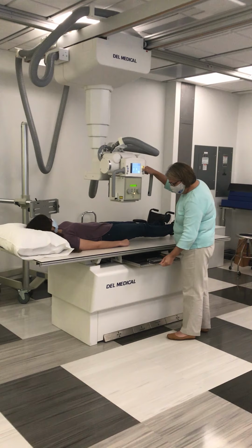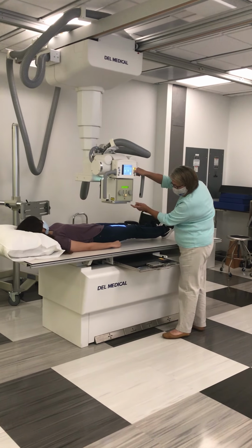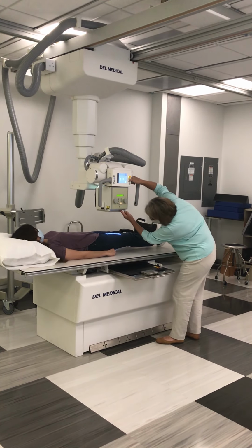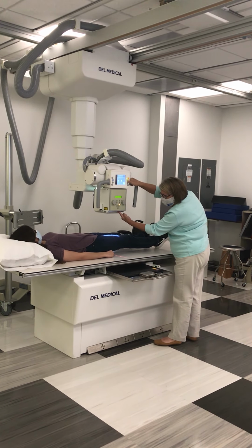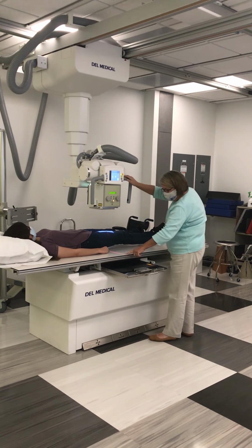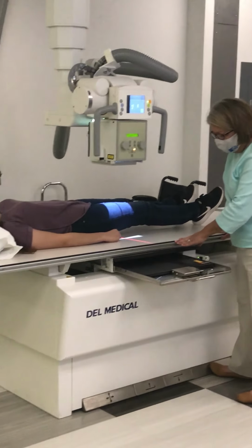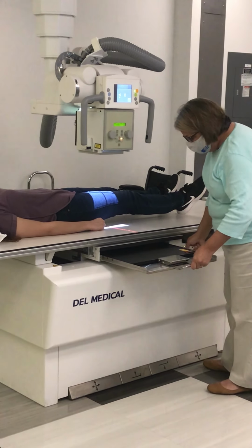However, we do have to align, and I want my red laser for this, and I see that it's not on. So there's this white button underneath that slides back and forth. I want to make sure that laser is on so that I can line up my central ray to my image receptor. I'm going to push the table away a little bit so that I can see that laser.